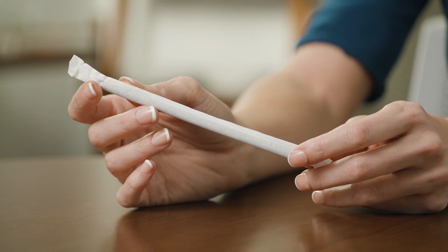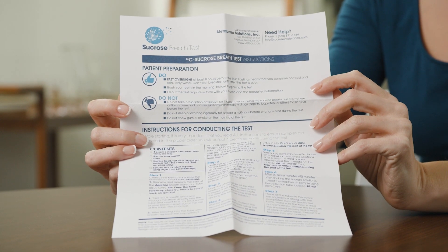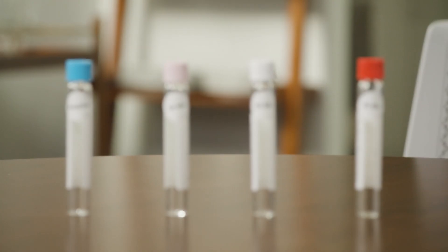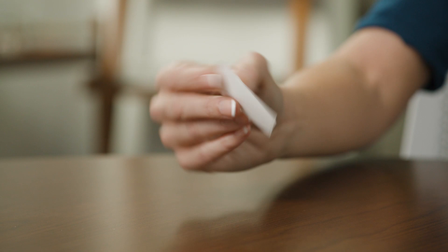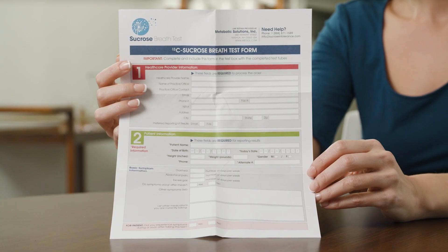Included in your C13 Sucrose Breath Test kit is a straw, instructions which clearly detail test preparation and instructions, a sucrose packet, 4 breath test tubes labeled with different time intervals, a white seal to close the kit after test completion, a prepaid USPS shipping label adhered to the back of the test kit, and a test form.